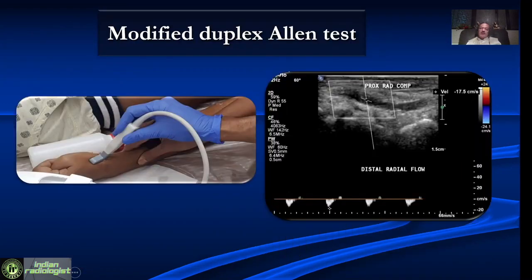There is also a modified duplex Allen test, where we keep a small-footed probe in the snuffbox, look at the radial artery, and then compress the proximal radial artery. If the palmar arch is patent, we get reversal of flow coming from the ulnar artery. Once you see a reversal like this, that means the palmar arch is patent.